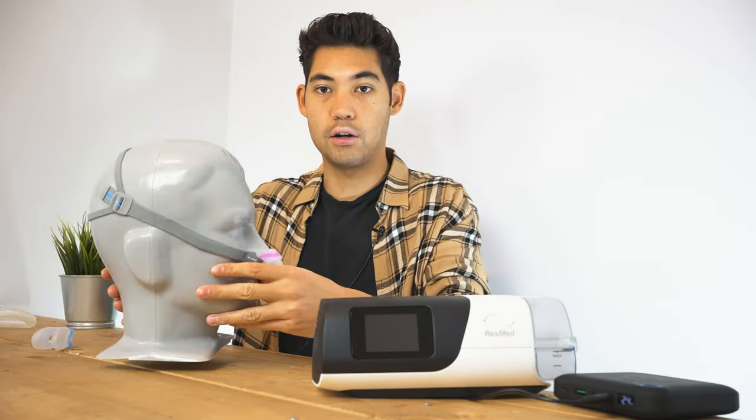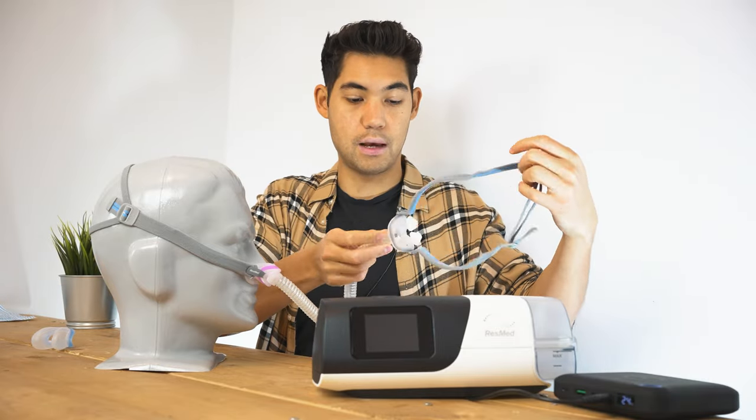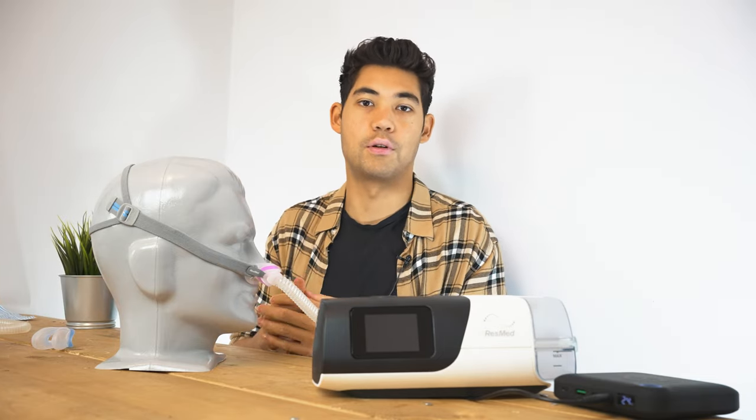So this is the mask here, and it is very similar to the P10. This is the P10 mask. The major difference is that this is a cradle mask, whereas the P10 is a nasal pillow mask.